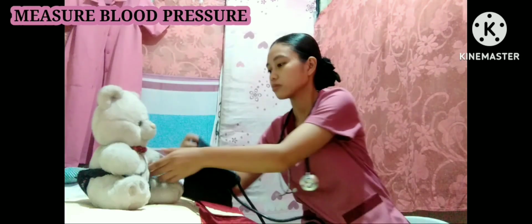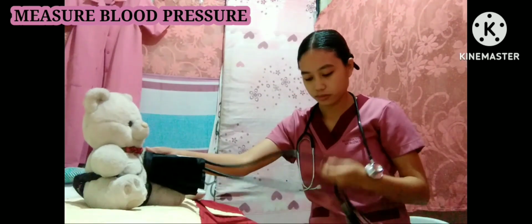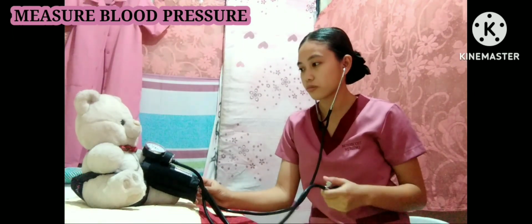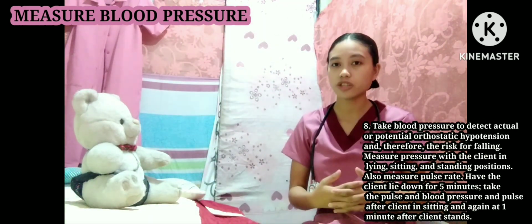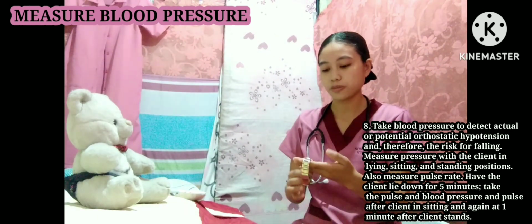So after determining the client's history, we measure the client's blood pressure. Sir, I'm gonna be measuring your blood pressure. So we take blood pressure to detect the actual and potential orthostatic hypotension and therefore the risk for falling. Okay, sir, I'm gonna be measuring your pulse rate.